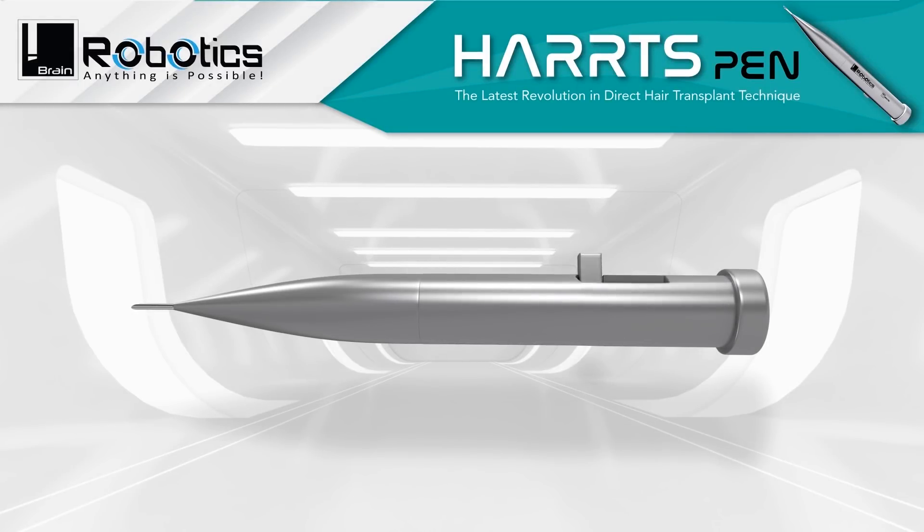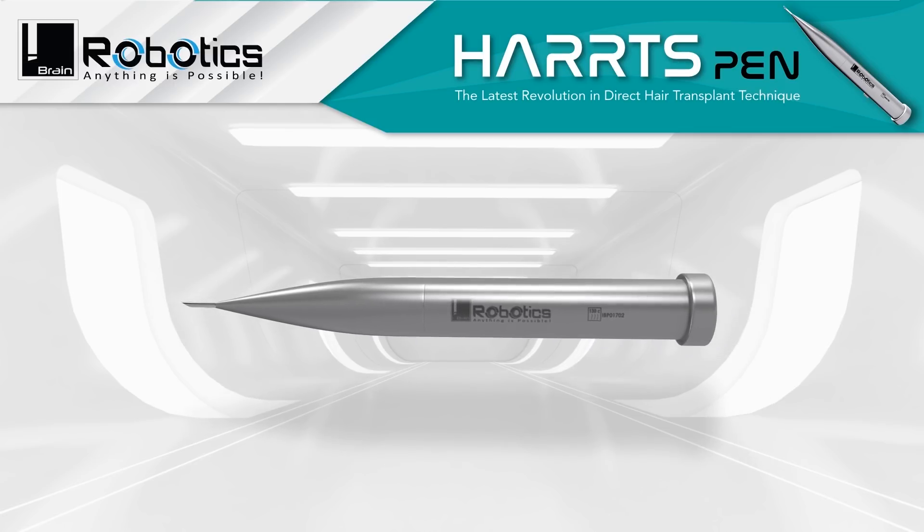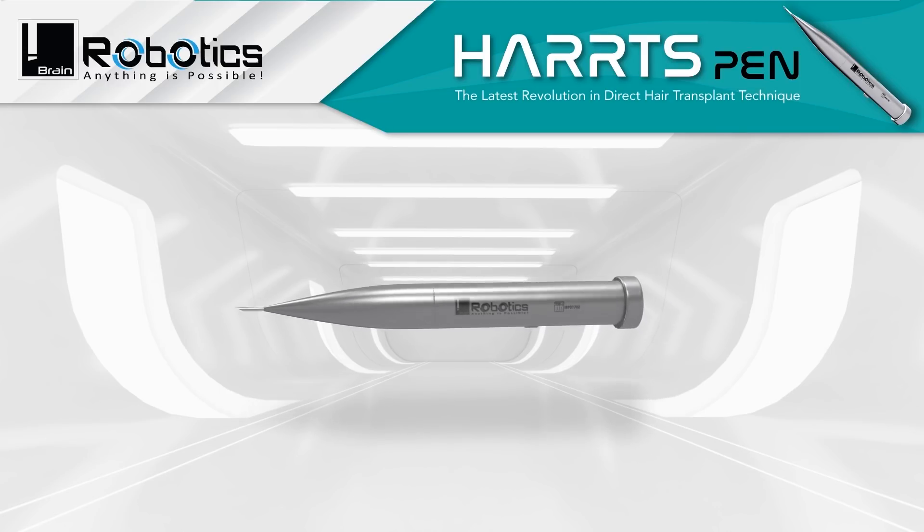HARRTS Pen: the latest revolution in direct hair implantation technique. iBrain now introduces a revolutionary HARRTS Pen to simplify and increase the ease of hair implantation.